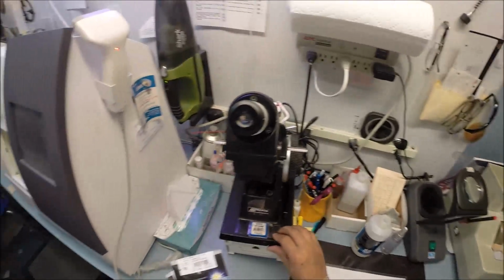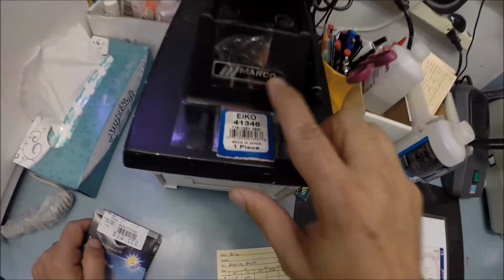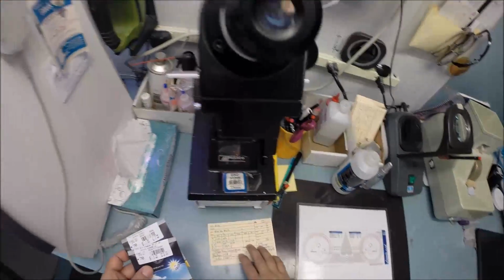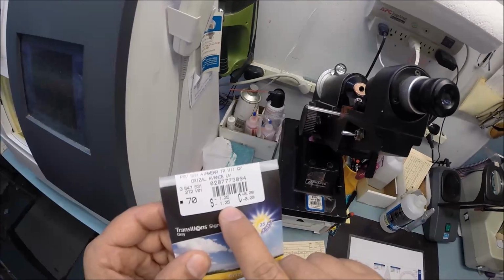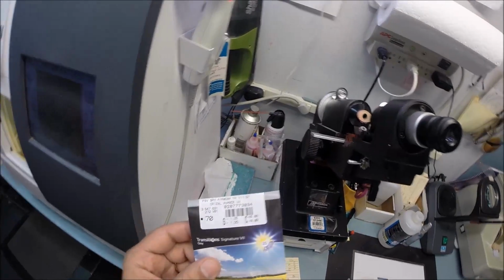I don't need the frame for that. Leave that down here. Let's come down to my Marco 101 lensometer. See the Marco? That's the type of bulb I use. -1 1/4. Sphere. That means you have no astigmatism. What's wrong? You couldn't afford any astigmatism? All right, so you'll just have to go without on your right eye.